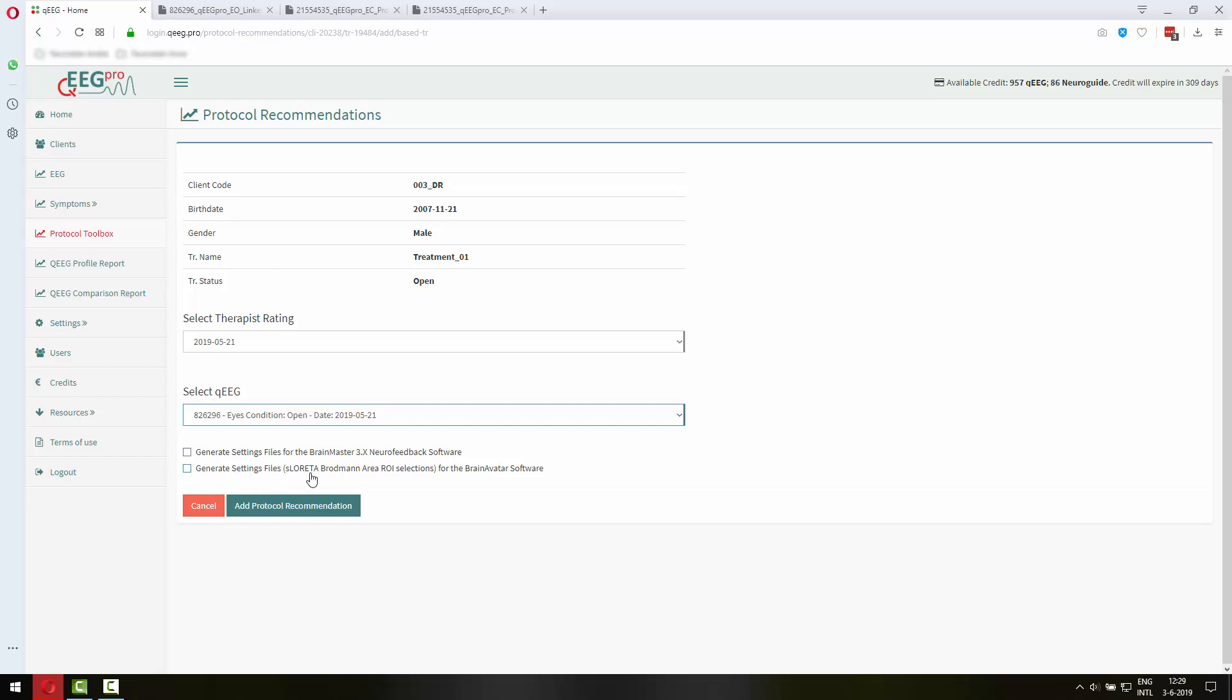And then here you now have the option to generate settings file. Both for the sLoretta Broadman area ROI selections for the Brain Avatar software and for the Brain Master 3.x Neurofeedback software, the classic software for doing classic neurofeedback. So if you tick these boxes you will get settings files.